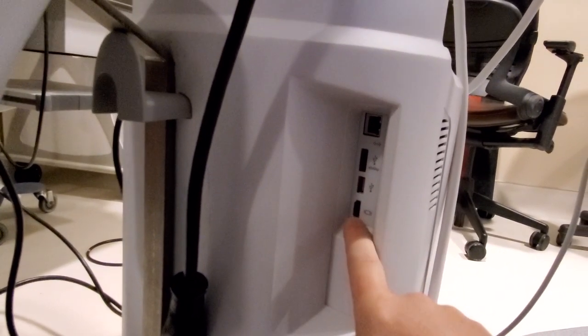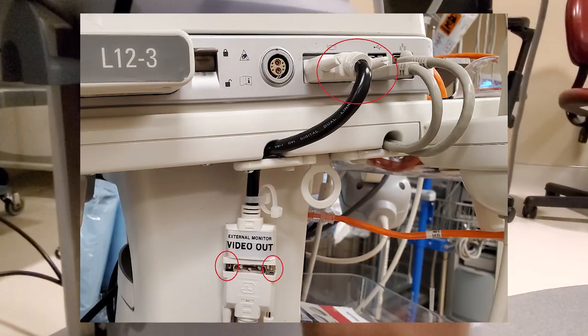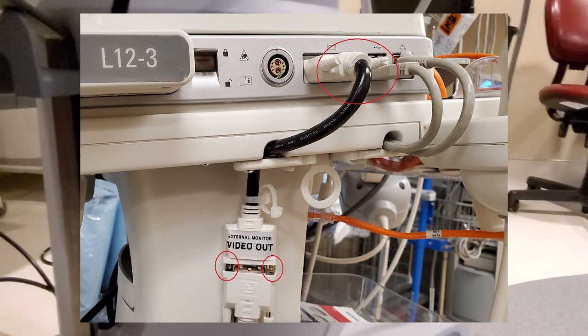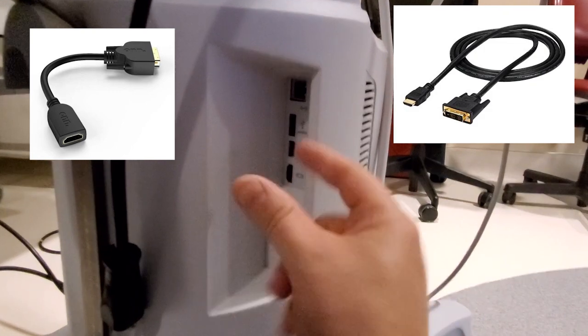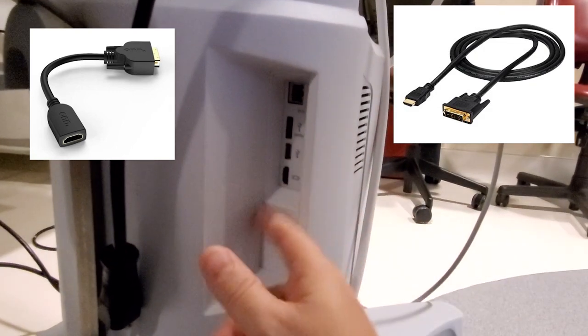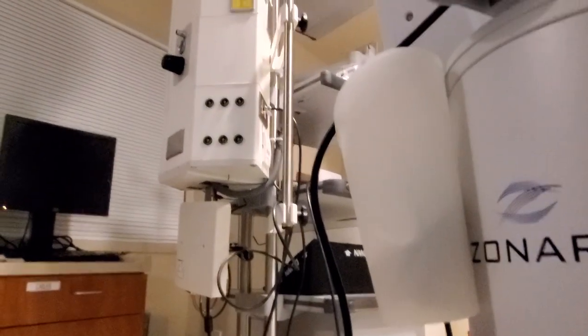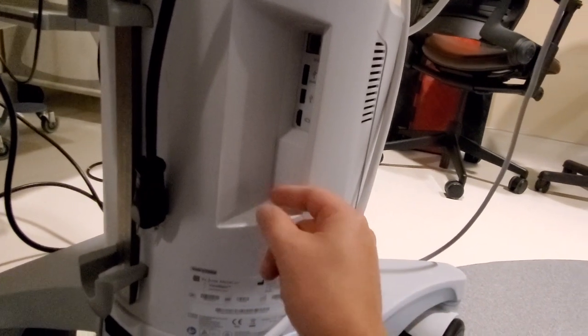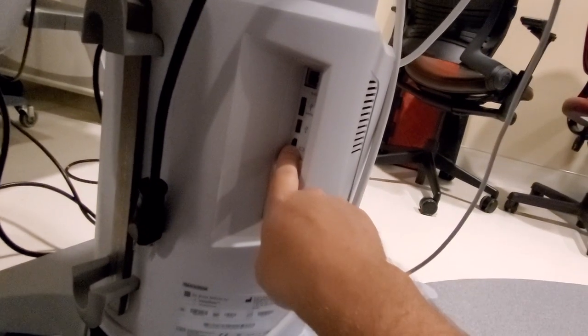So try and get a HDMI or DisplayPort extension. And when you have DVI cables, DVI are the longer video cables that have fastened down lugs at both sides, I try and take a DVI to HDMI adapter and plug that on your device, because then you can run an HDMI connection out of your machine to wherever, to the boom, to the video boom, which is going to be right there. And that allows you, if they move the equipment away from the boom, it'll separate at the HDMI connection.